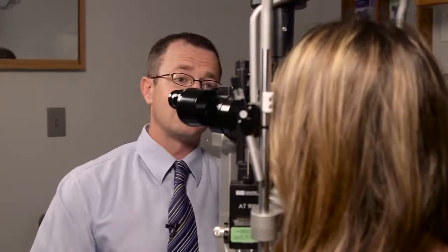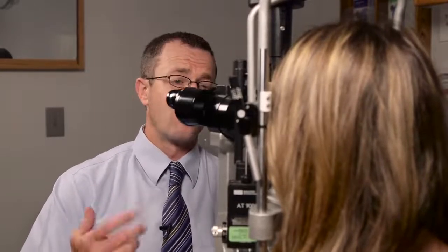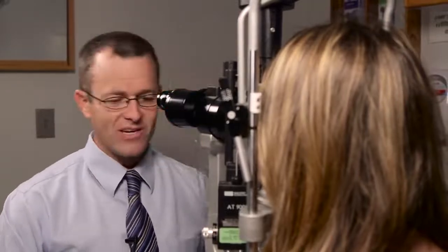Sometimes patients will be light sensitive. Their pupils are dilated, they may have inflammation or redness, or for whatever reason they may be light sensitive. But I do think it's important to make sure you use enough light so you can see, and then just be patient with the patient to make sure that you don't blast them with light too bad.